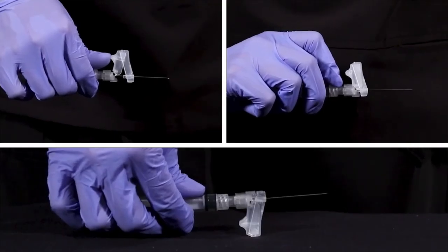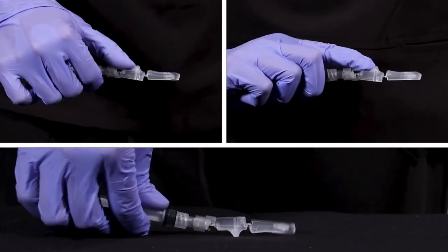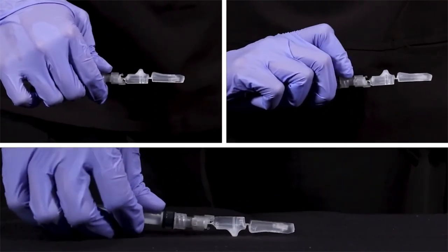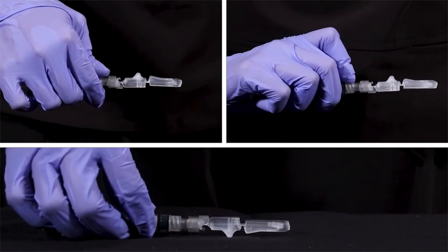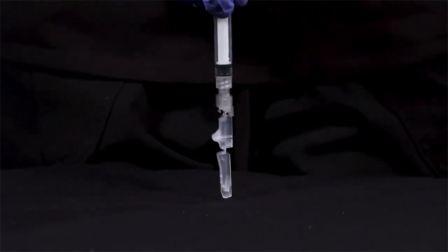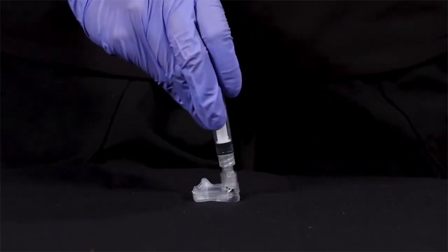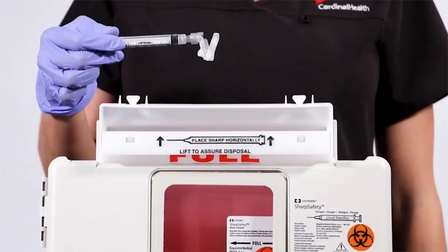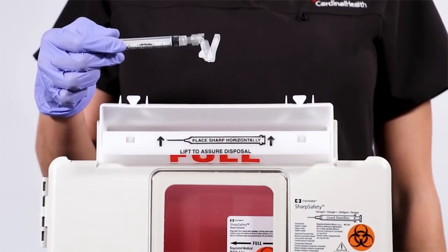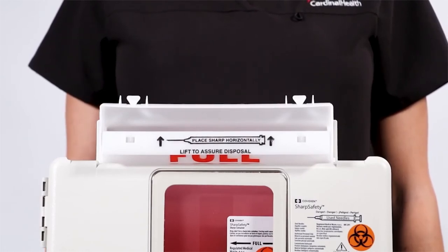No matter which method you use to activate the Magellan safety hypodermic needle, you will hear the click and feel the shield lock into place so you know you're protected. A robust shield provides unparalleled protection during and after disposal. For your clinicians and downstream workers' safety, immediately dispose of the needle and syringe in an approved sharps disposal container.